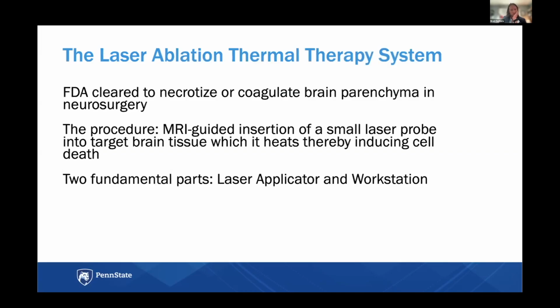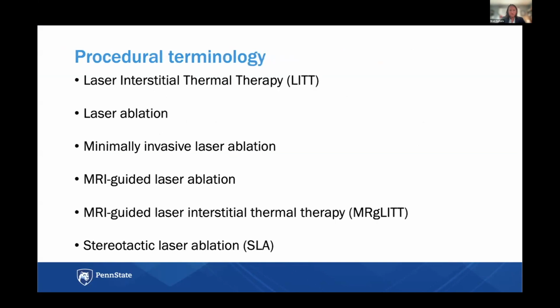The laser ablation thermal system is FDA approved in the United States to necrotize or coagulate brain parenchyma. Basically the procedure is the insertion of a small laser probe to a target, and then heat induces cellular death. There are really two fundamental parts: the laser applicator and then the actual workstation, the business end of it. This goes by a variety of terms, all of which are really interchangeable: laser interstitial thermal therapy, or LITT, laser ablation, MR-guided laser thermal therapy, etc. All of which are connoting the same thing.